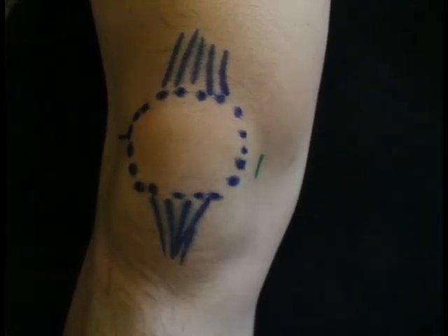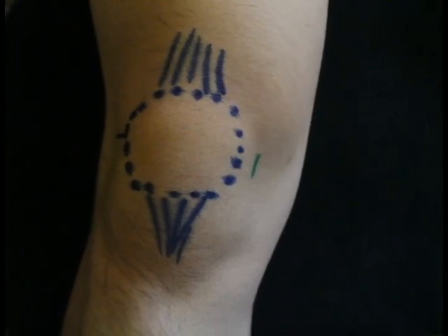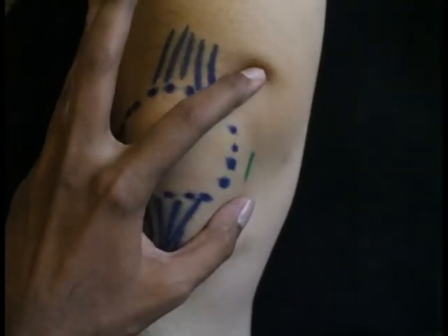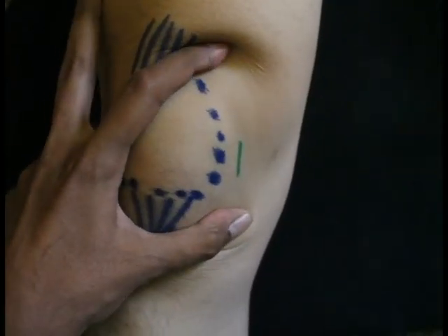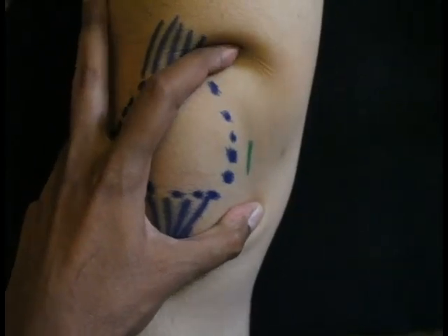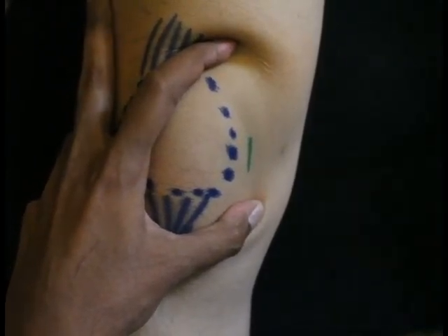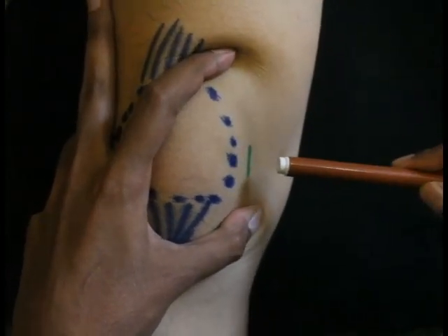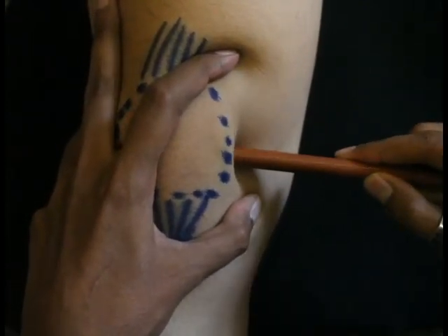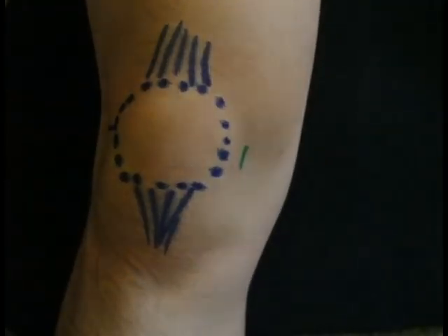Wash the skin and surrounding area with povidone-iodine solution using a sterile technique. Stretch the marked area of skin with your non-dominant hand — evidence shows stretching the pain fibers can reduce discomfort. Direct the needle perpendicular to the long axis of the femur towards the intercondylar notch and aspirate with a 20 ml syringe.